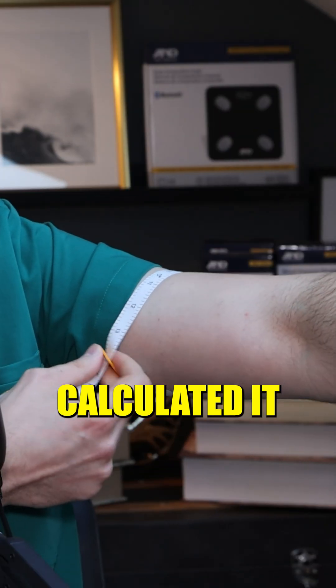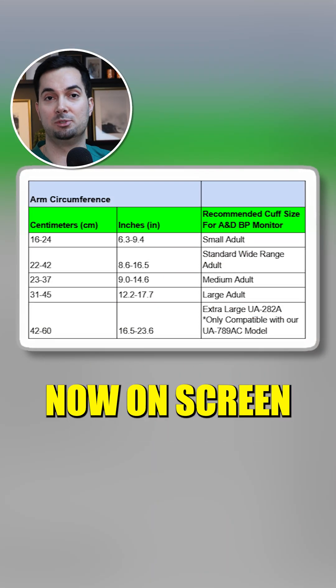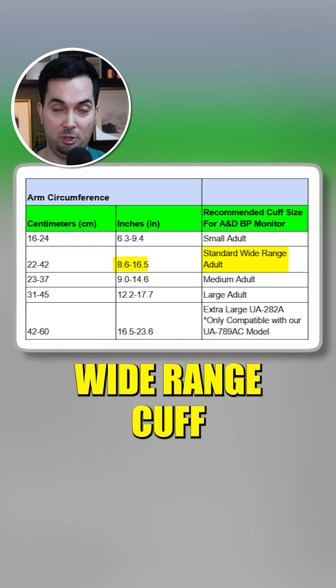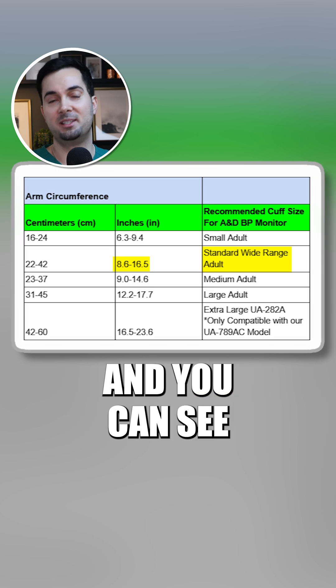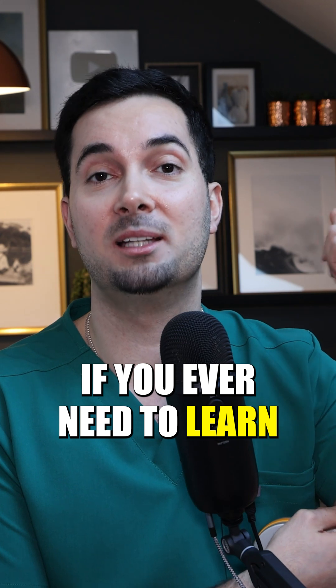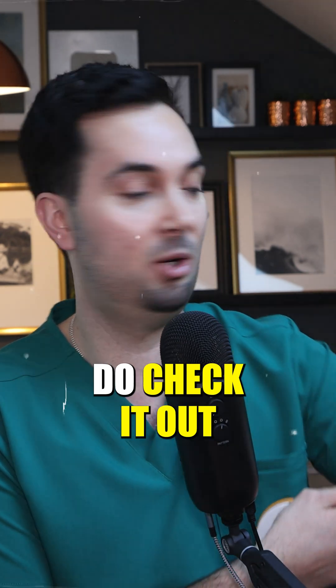I know my midpoint is here because I've already calculated it. My arm circumference is about 12 inches. If you look at the table now on screen, you're going to see that my arm at 12 inch circumference is correct for our wide range cuff that comes with most of our devices at A&D Medical as standard. You can see the small adult cuff is too small for me — that's the one I'm using for this experiment. If you ever need to learn how to measure your cuff size properly, we have a video on it, so definitely do check it out.